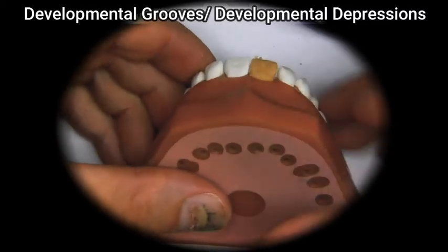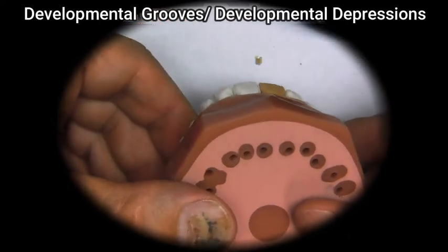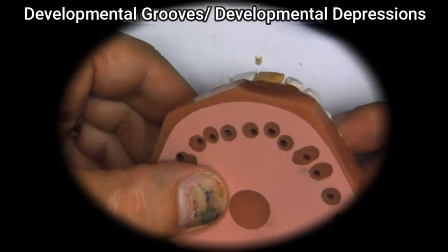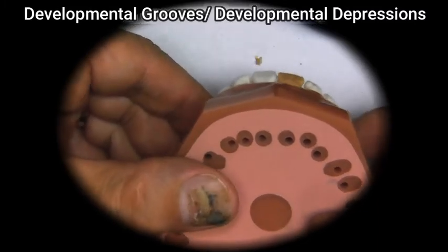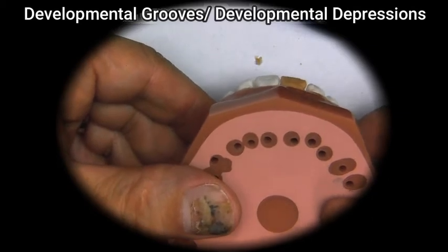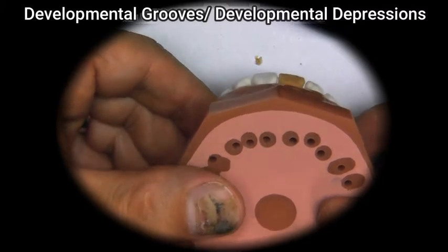So if we move the model in different angles, we can see the little differences that we need to correct. Like for instance here, we see that the incisal edge of number 8, which we're waxing, is a little bit further in than number 9. So we have to bring that out a little bit.